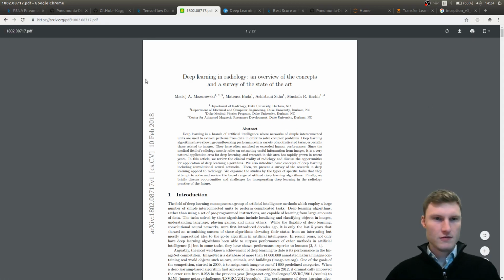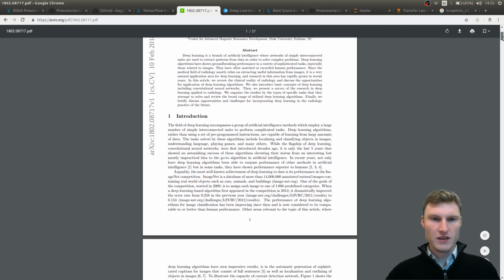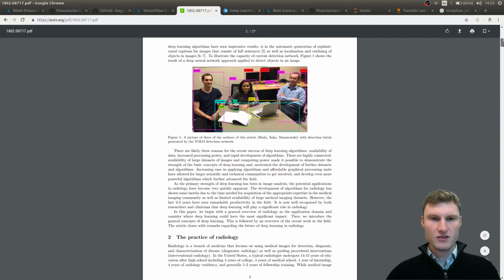About radiology, there is one article on Archive from these guys, and it's about deep learning in radiology, an overview of concepts. They published it this year, 2018, and I believe it's a very good summary of what is done in radiology nowadays. Here you see a YOLO. This isn't a classification, this is a detection model, so you can detect various objects, which could, for example, be used for detecting areas of interest.